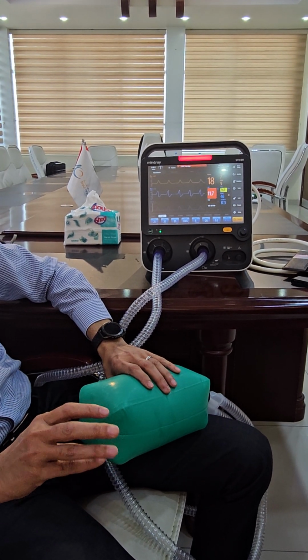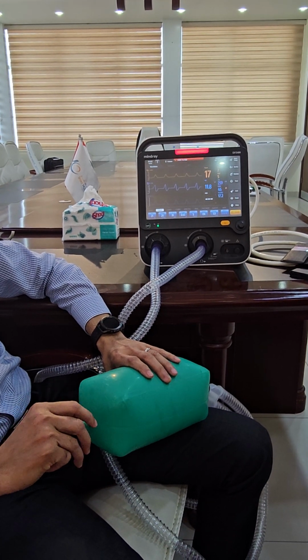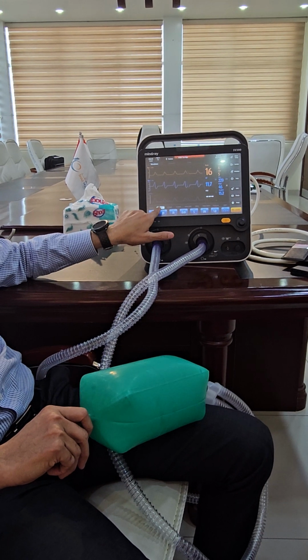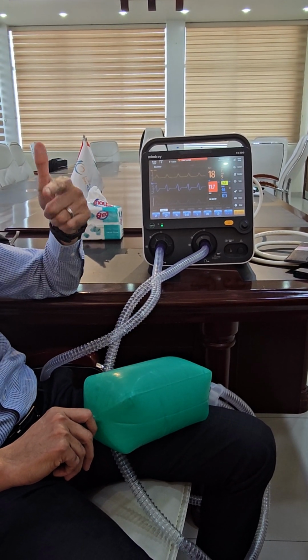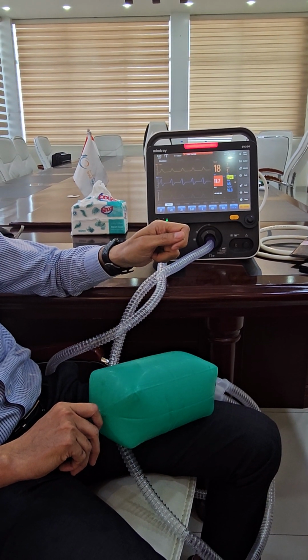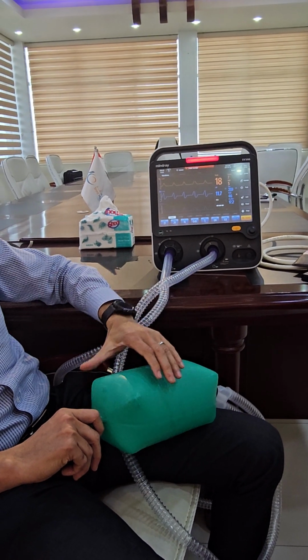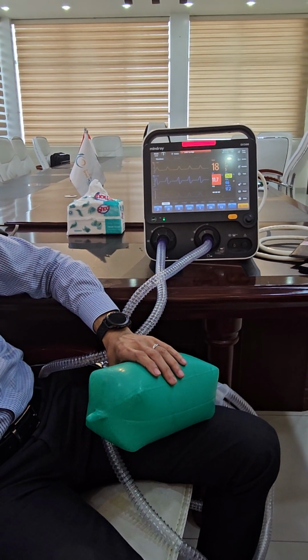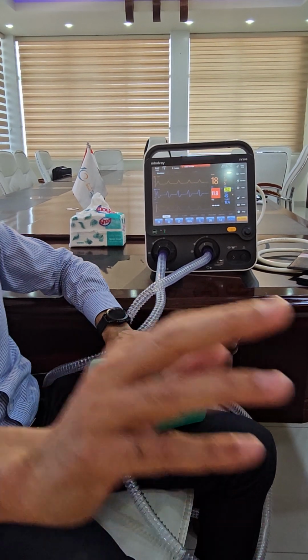In AC, remember, phase variable, conditional variable, and type of breath. In AC, we control the rate, and the patient has to be supported. If you breathe more, then we have to tell the ventilator when to support. And that's the trigger. So we'll tell the machine, when the baby breathes at this level, help. If they breathe less, don't help. And the trigger has many types.